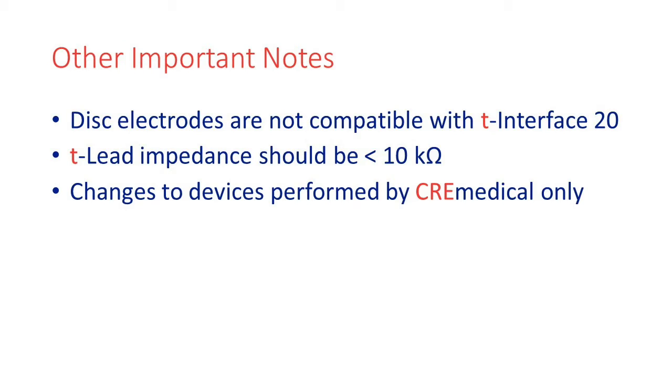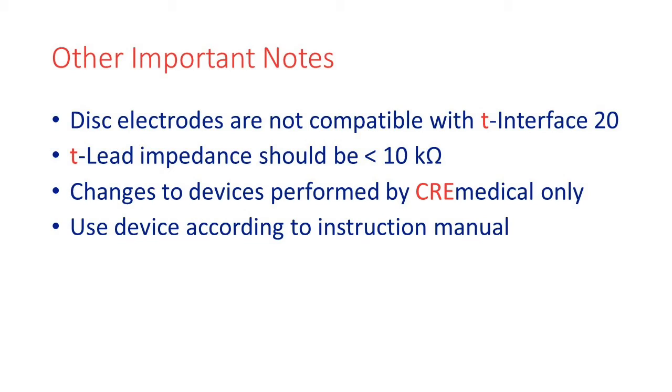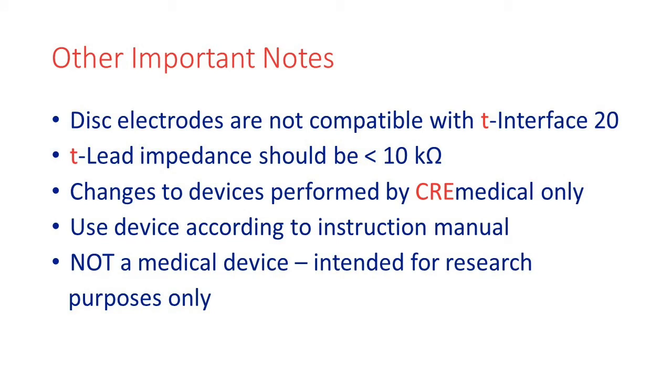Any necessary changes to the device must be performed by CREmedical only. Be sure to use the device according to the instruction manual. The instruction manual is included with your order on a USB stick. Lastly, and most importantly, the T-leads and T-interface 20 are not medical devices. They are intended for research purposes only.